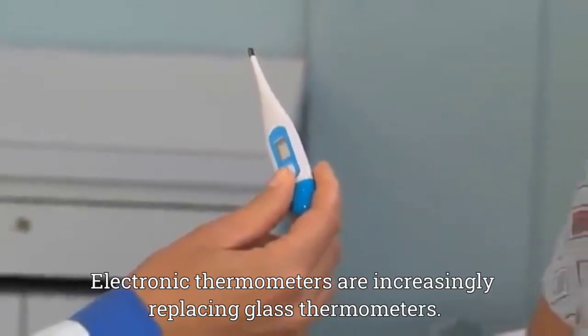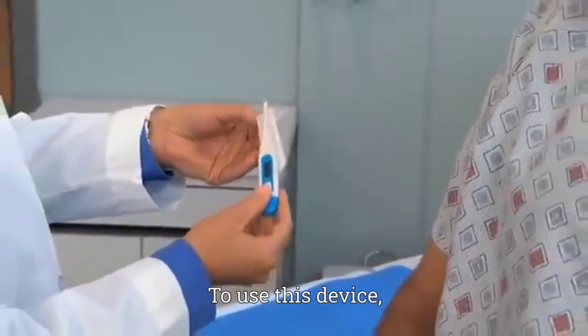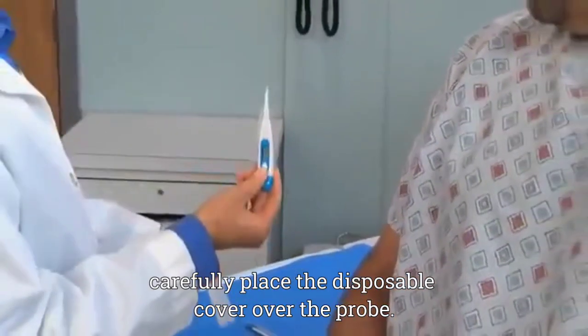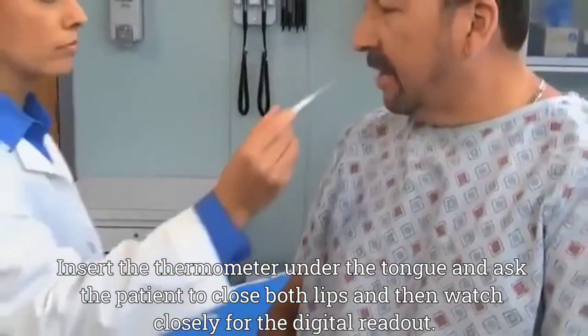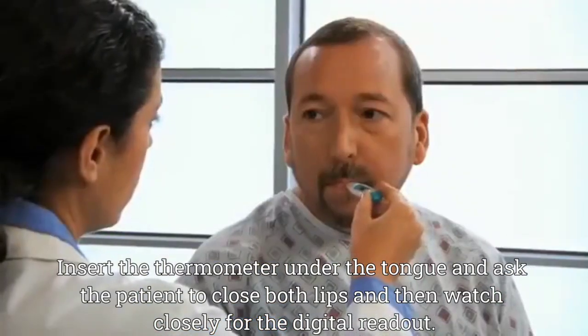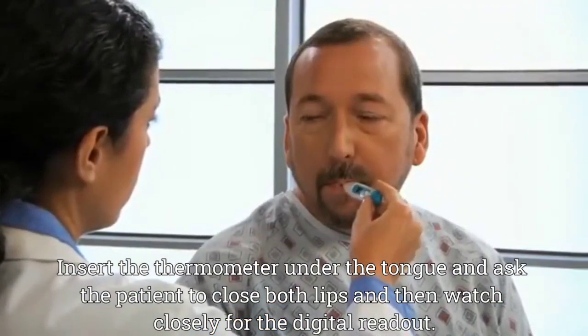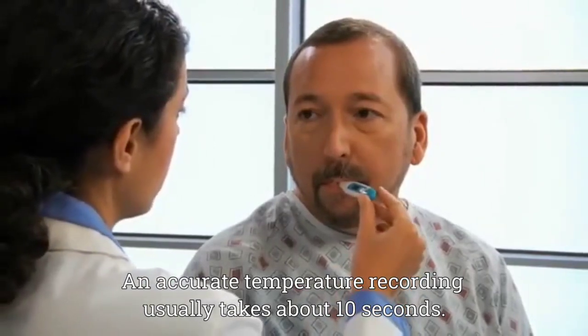Electronic thermometers are increasingly replacing glass thermometers. To use this device, carefully place the disposable cover over the probe. Insert the thermometer under the tongue and ask the patient to close both lips, and then watch closely for the digital readout. An accurate temperature recording usually takes about 10 seconds.